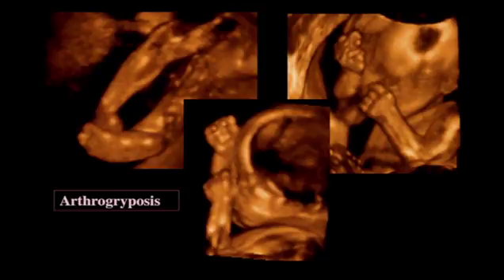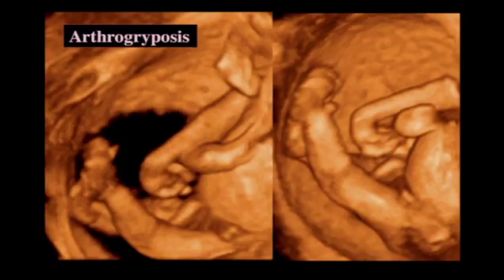There's a lot of contractures. These arms and legs are not moving, and the hands are all together in a very unusual stance. And sometimes when the fetus hasn't moved for a very long time, then you see this severe extension of the lower extremities, which is very typical of a fetus that's just absolutely contractured, just like some old people in nursing homes might be if they haven't been moved for a very long time. They have the same type of contractures from lack of moving.